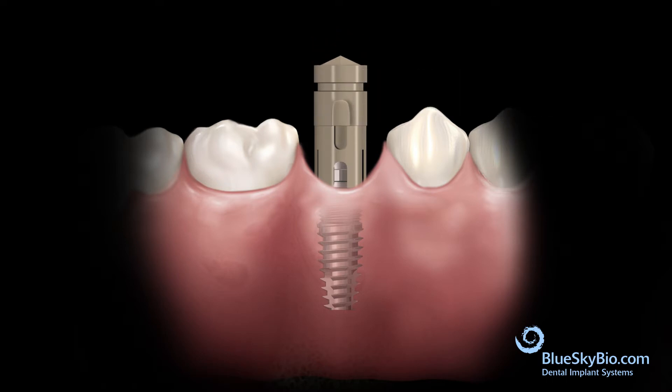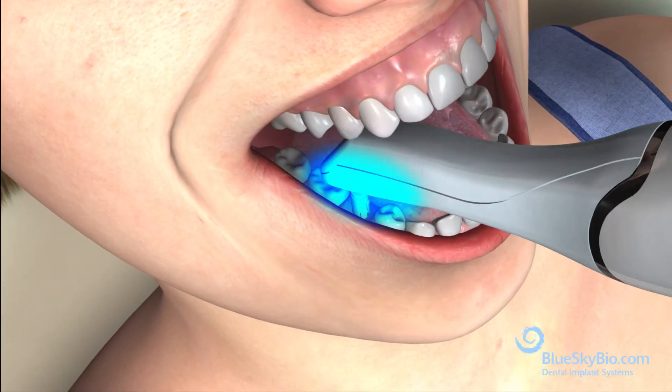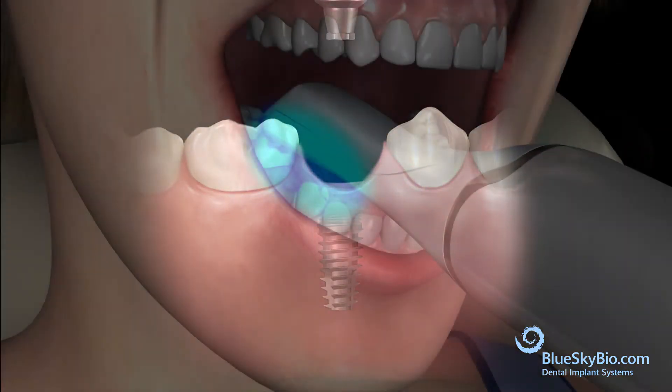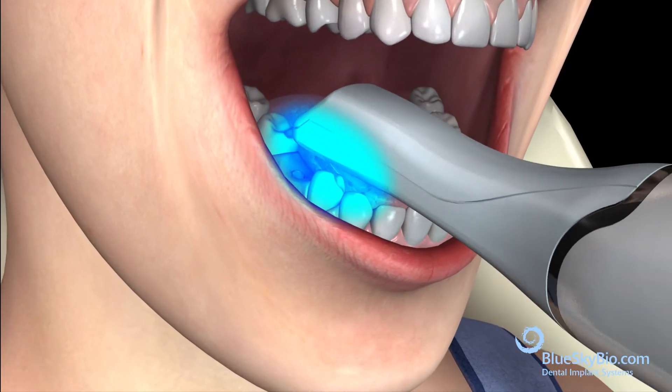A scan body is seated fully on top of the Rosetta adapter with firm pressure. Scan the area with the optical scanner. Remove the scan post assembly from the titanium base abutment and scan the tissue directly over the implant to capture the soft tissue geometry.